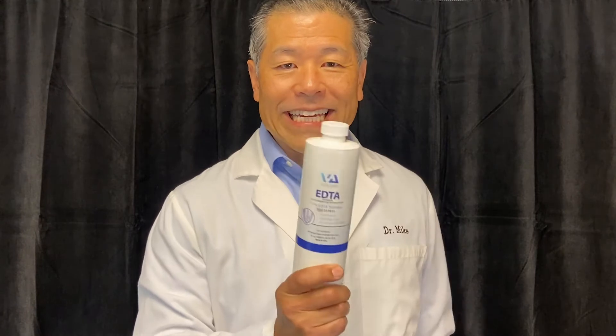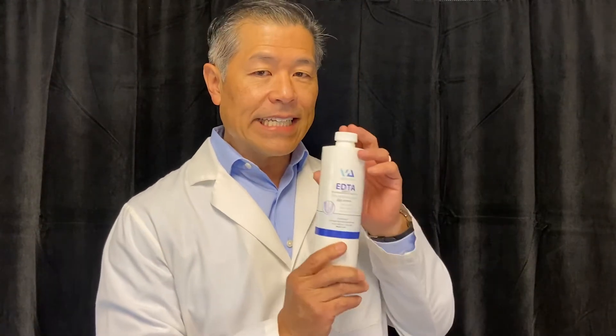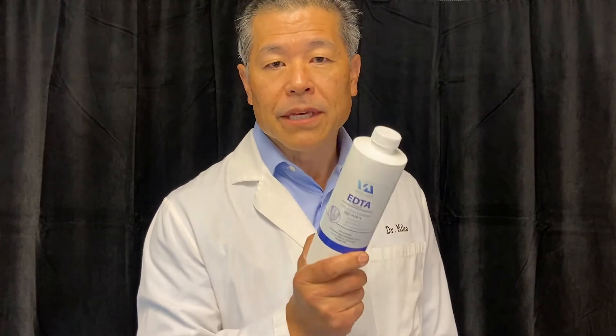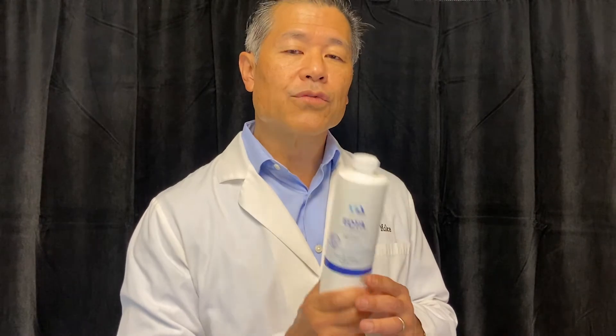Once we've gotten into the canals and started to clean them out, there's dentinal mud — the smear layer — plugging up all those lateral canals. The next step is EDTA. The Vista Apex EDTA is 17 percent, but it's optimized at a pH of 8.5, which has been shown to give the most effective cleansing action. We get the EDTA down into the canals to remove the dentinal mud and open up the lateral canals, and then the sodium hypochlorite can get into those lateral canals and clean them out even better.